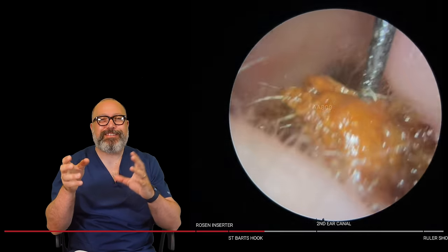Let's take a look. But no, there's still more in there. Let's get this one out as well. There we go. Out that one comes. That's got to be the end of it now. No, a little bit stuck around the corner. Let's get rid of you. My goodness. There we go. And that's not a small plug either that was stuck around the bend in that ear canal. That was pretty chunky. Let's take a look.